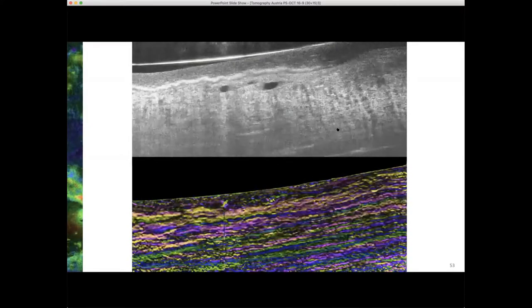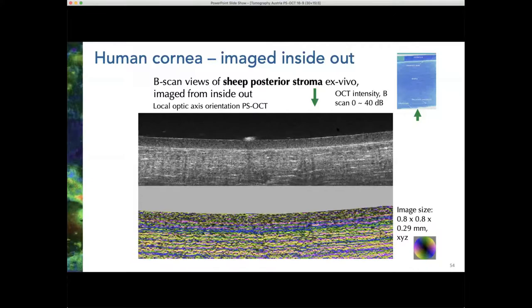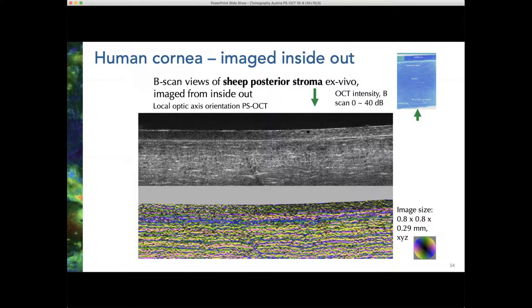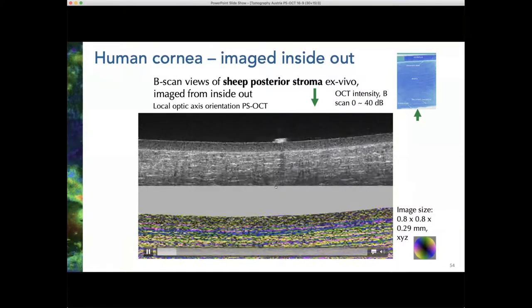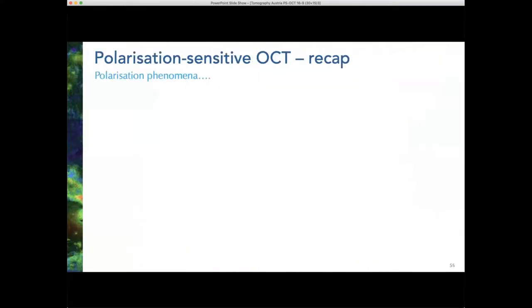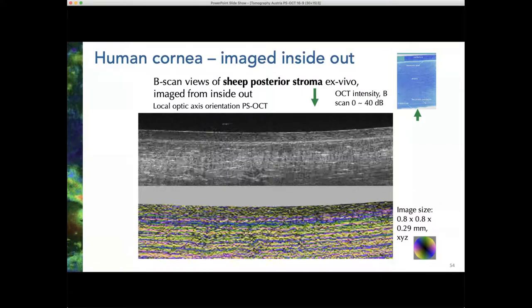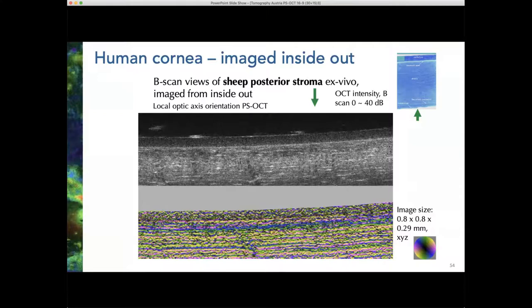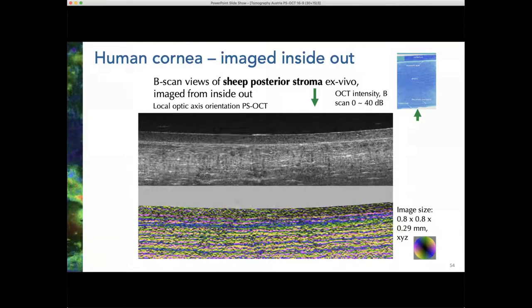This is now imaging a cornea from the bottom. The layers are very close together. There's a cellular layer at the surface that appears salt-and-pepper because there is no consistent layering there. You can almost see the cellular structures that exist in that very bottom portion close to Descemet's membrane — remembering we're imaging it upside down.